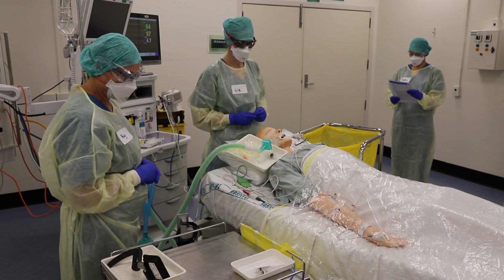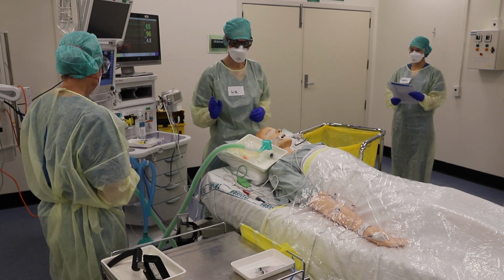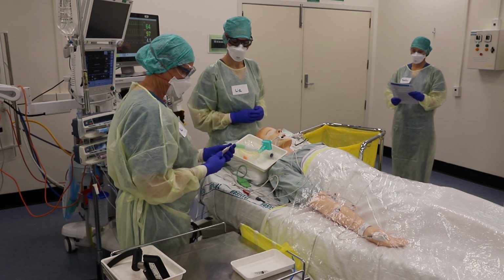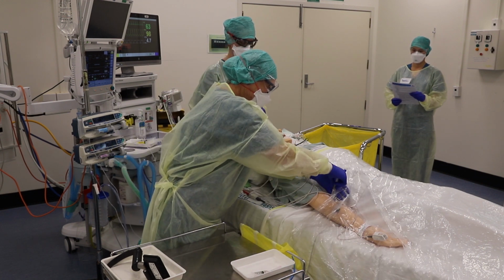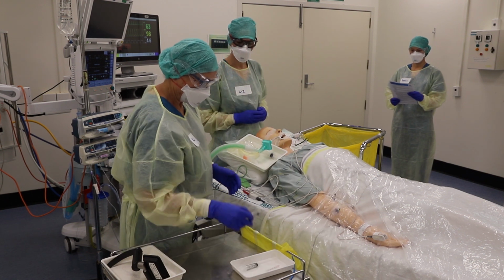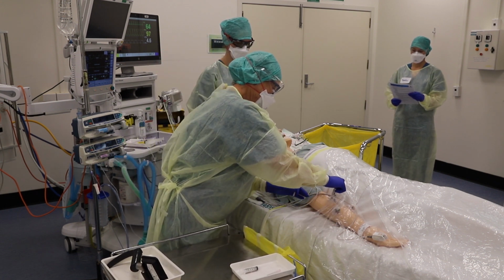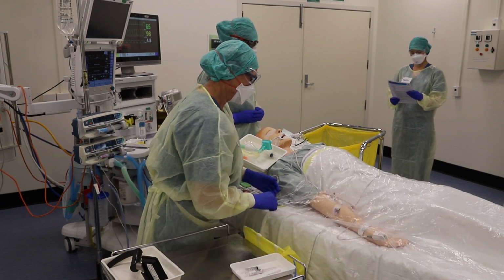Reverse paralysis. Okay, so we've got remifentanil running as an infusion. Can you please give the 5 mils of lignocaine that are in that tray there? And then there's some Sugammadex there as well. Could you give 2 mils of Sugammadex, please? Perfect. Given. Thank you.